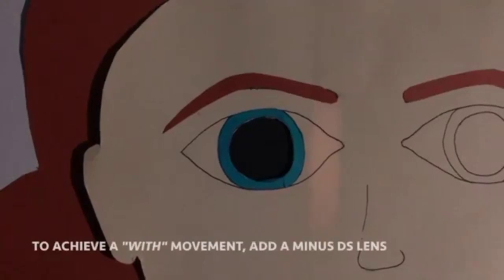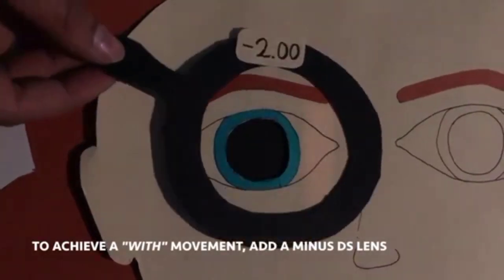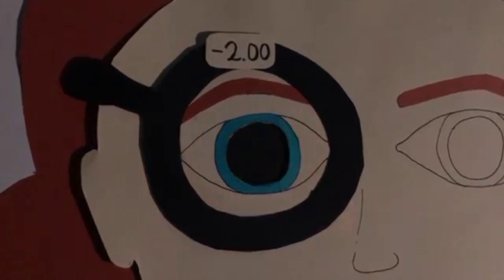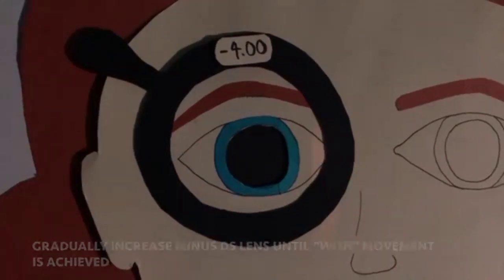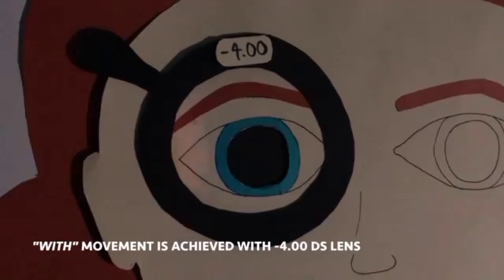In order to achieve a with movement, the application of a minus lens is required. With the use of the -2 lens, Ahelia still demonstrates an against movement. Hence, the minus power needs to increase in order to achieve a with movement. As now with the -4 lens, we can see that a with movement is being demonstrated.